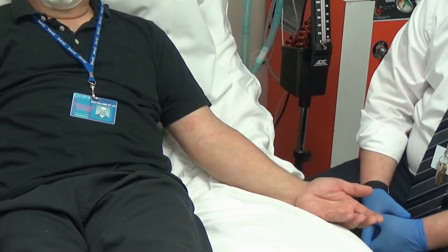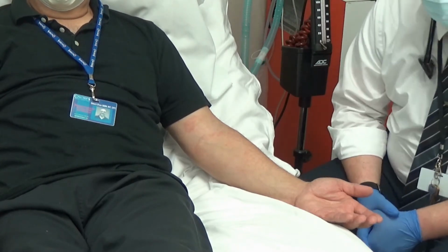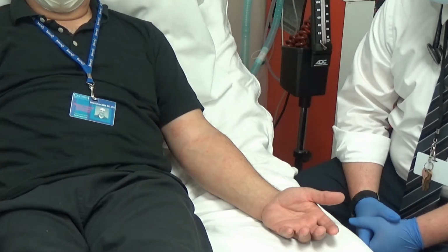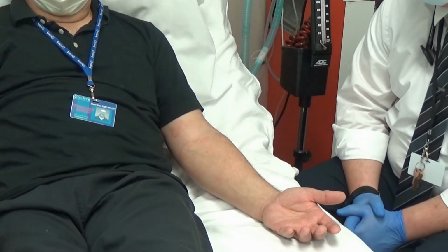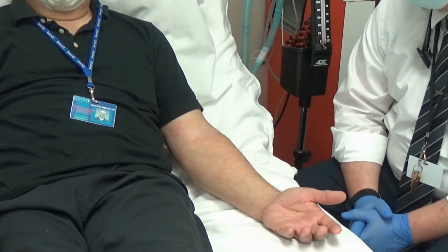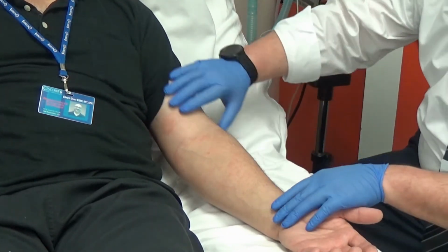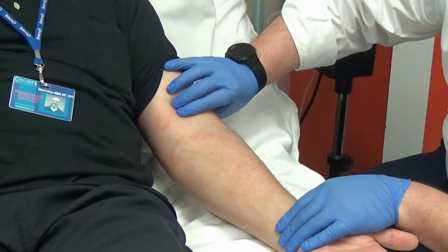The first thing when you are doing manual blood pressures, like I said, is to make yourself comfortable. As you can see, I grabbed a chair. I don't know what you'll have to do in 240, but for this demonstration, I'm going to make myself comfortable. What you typically want to do is feel for a brachial pulse.